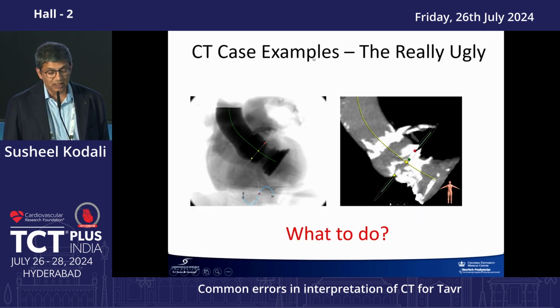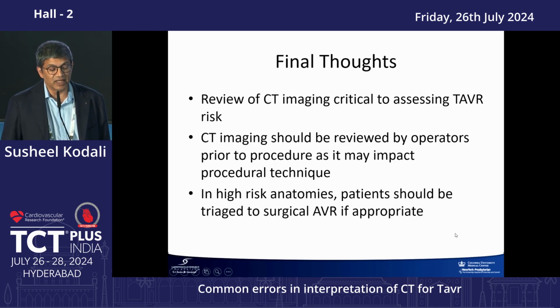And sometimes you really should just stay away from the patient. If anatomy looks like this, no device is going to get a good result. And sometimes we're forced to do them, but it's important that you understand what it is and have that conversation with the patient about risk benefits.